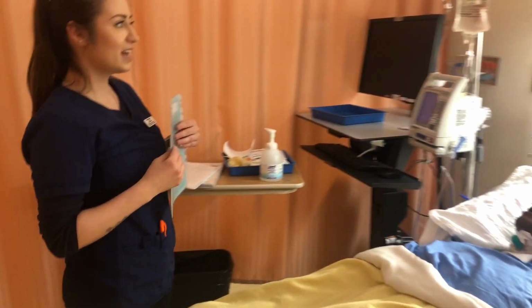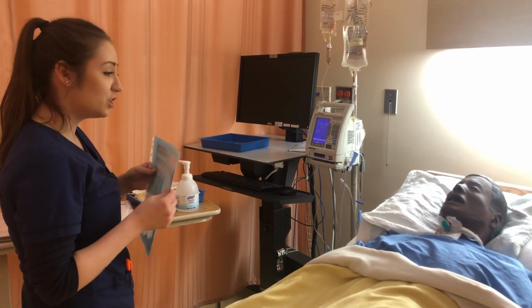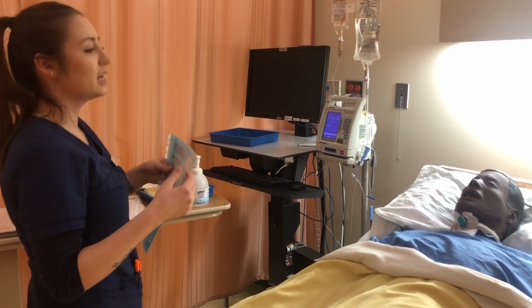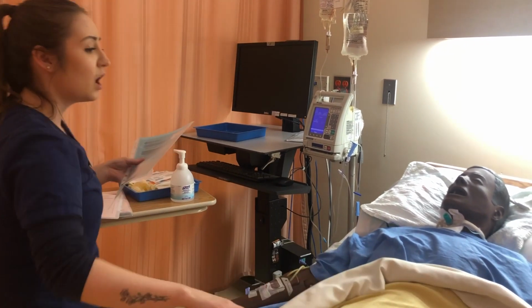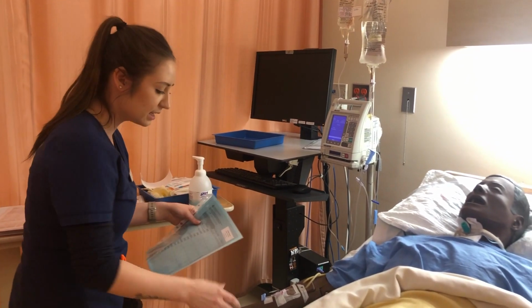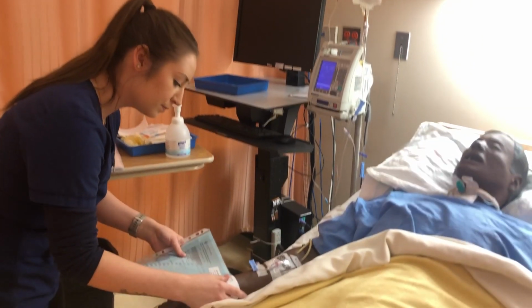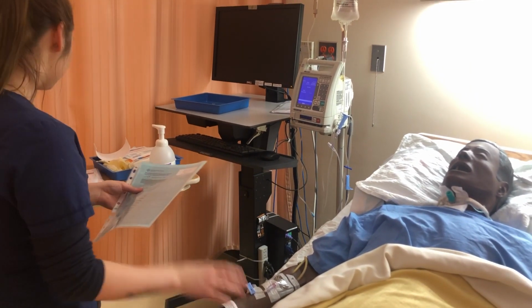started. So, hi, my name's Savannah. I'm a student nurse. Today I'm going to be starting your insulin infusion as well as doing a chest tube dressing change. Is that all right? So the patient does have the right to refuse at this time, but because they don't, I'm going to continue. I'm just doing a general safety check when I get in here too, making sure my patient's not in distress. Can you state your name for me and your birthday? Good, so I know I have the right patient.